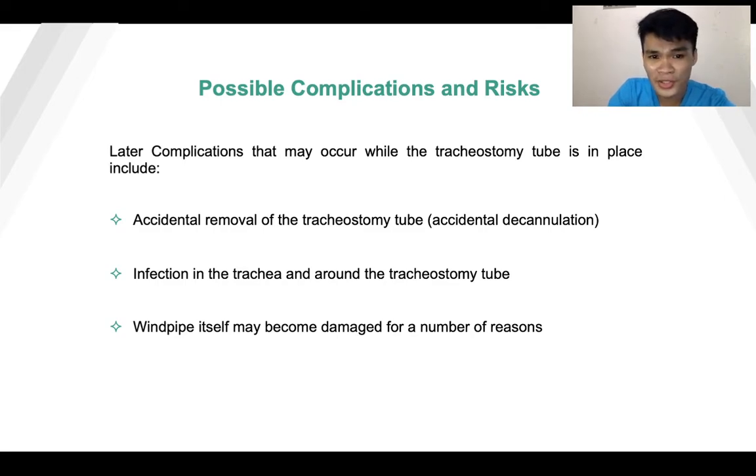The later complications that may occur while the tracheostomy tube is in place include accidental removal of the tracheostomy tube, which is accidental decannulation. Take note, guys, that decannulation is a process whereby the tracheostomy tube is removed once the client no longer needs it. So this one here is accidental decannulation.